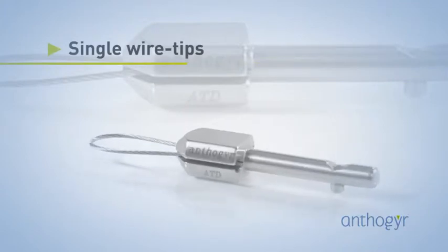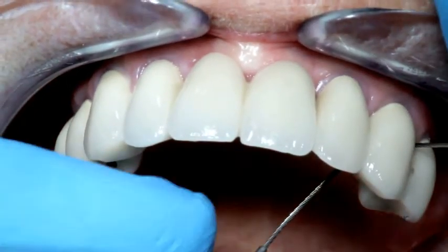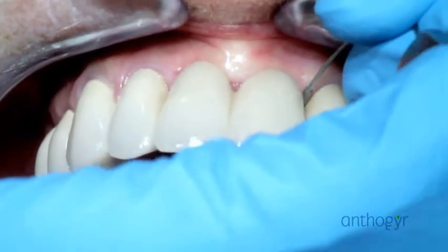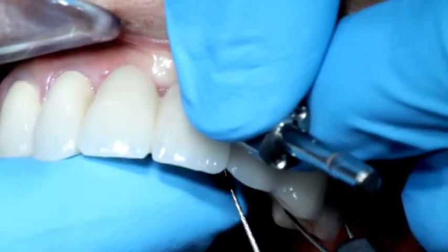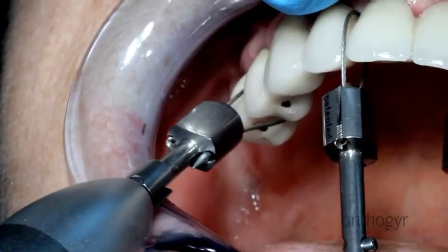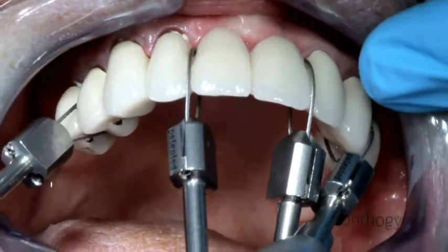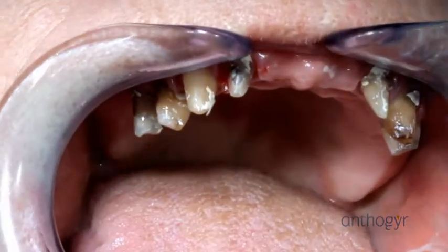In this case, a very wide maxillary bridge must be loosened. For this purpose, 50mm and 60mm wire tips will be placed all along the bridge. The 60mm cables will be placed in the posterior zone. It's important to distribute the wire tips uniformly in order to always work along the axis of the abutment teeth. The crown remover is then moved from one wire tip to another in order to distribute the pulling force over the different abutments. Once removed, it's obvious that the abutments are not damaged and that the bridge remains intact and can be resealed.